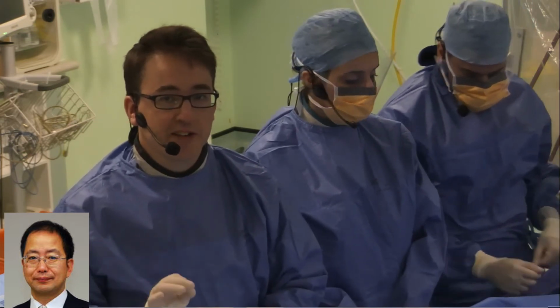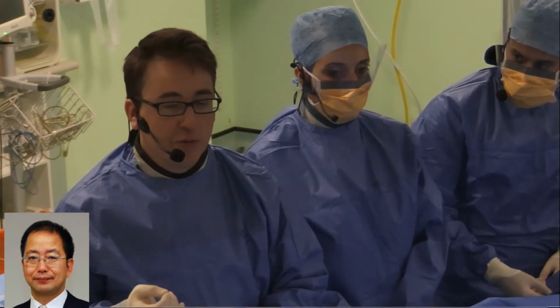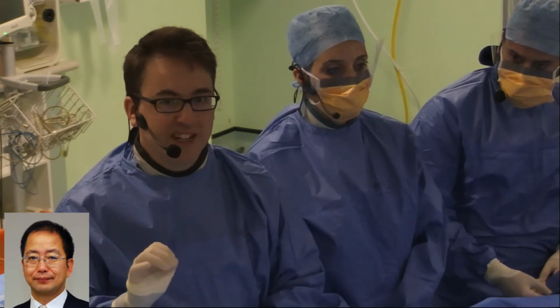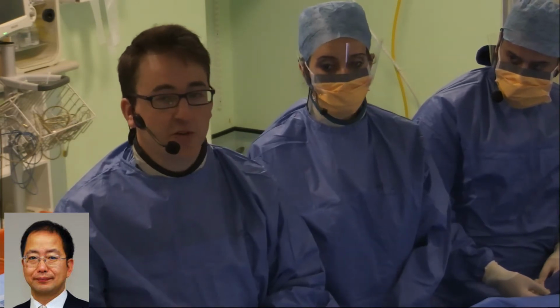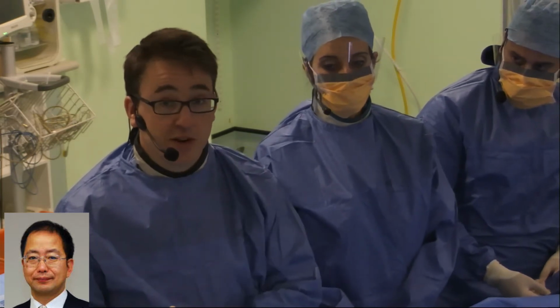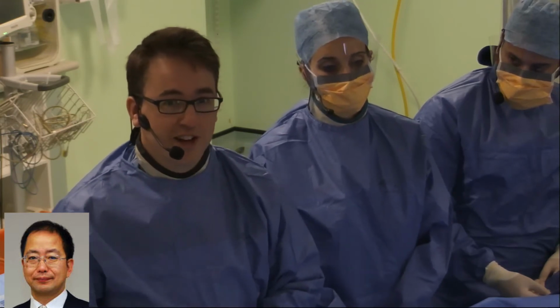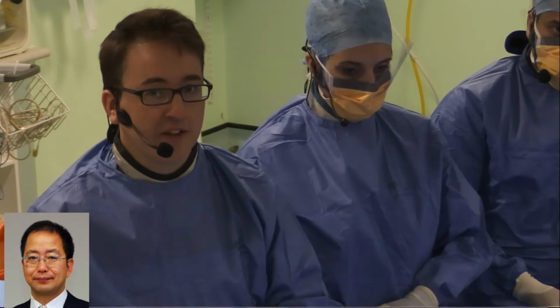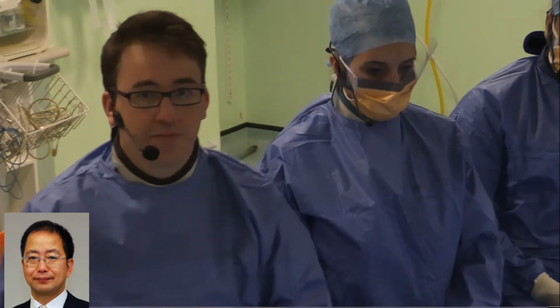The only extreme cases I'd say is if you have a vessel which you've induced a lot of ischemia, or perhaps you've got nasty 3-vessel disease, and you've just got one vessel which is patent, and then if you give heparin or you pass the wire down, sometimes you'll induce ischemia itself. And in those situations, you know the vessel is very significant and you've got a very low threshold for treatment. But it's just having that knowledge to be aware that in those cases things can differ. In 99% of cases that won't be the case, and 1 minute will be adequate.